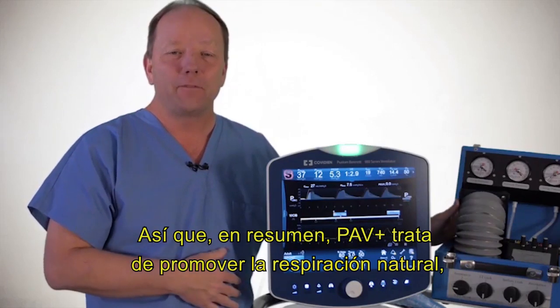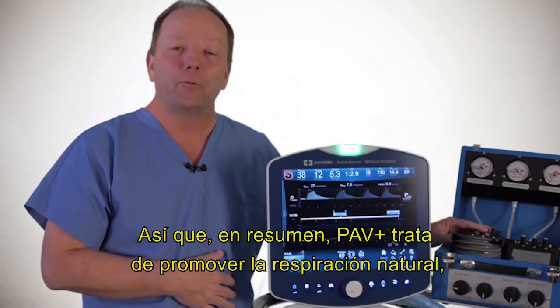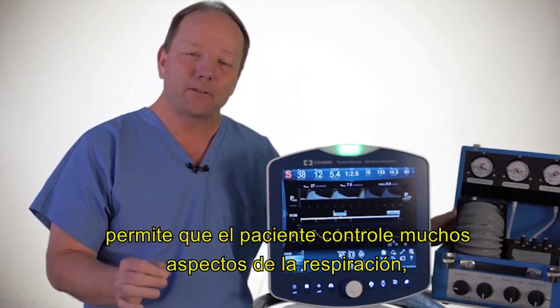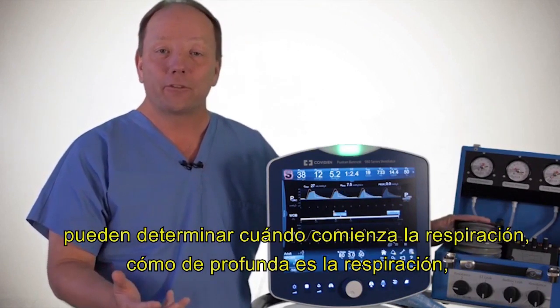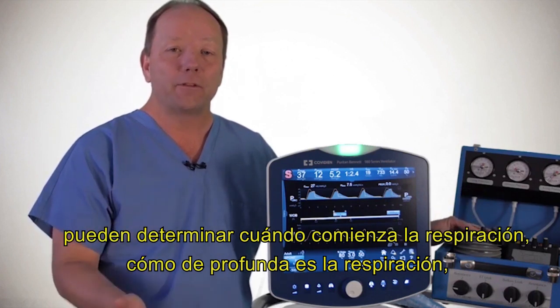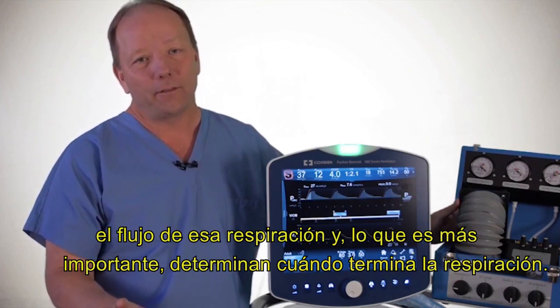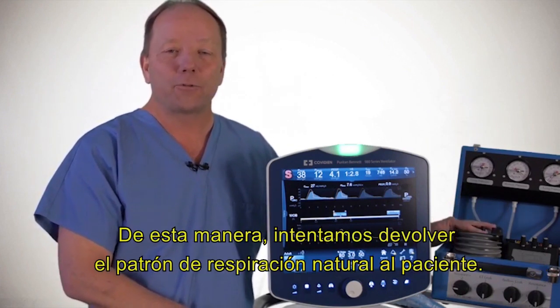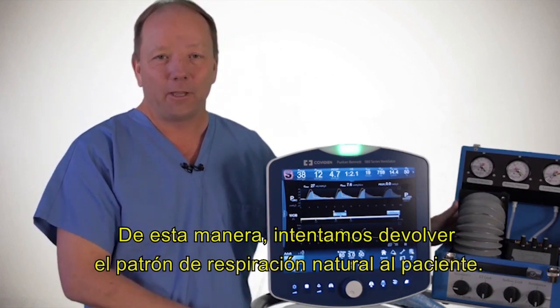So in summary of PAV Plus, PAV Plus is trying to promote natural breathing. It allows that patient to really control many aspects of the breath. So they determine when the breath starts, they determine how deep the breath is, they determine the flow of that breath, and importantly, they determine when the breath actually ends. So in this way, we try to return the natural breathing pattern back to the patient.